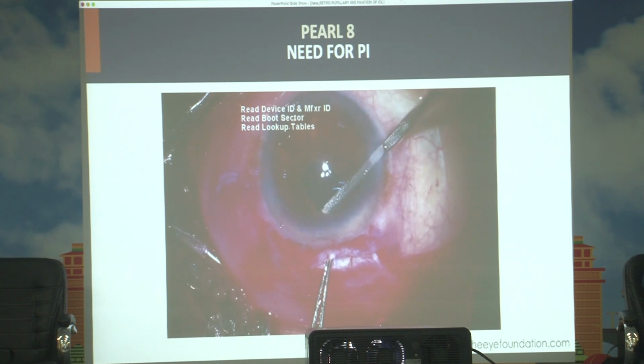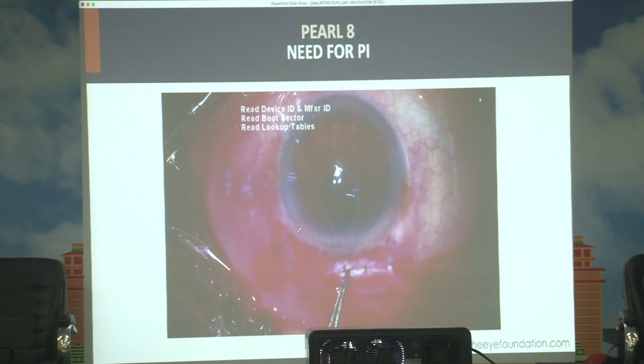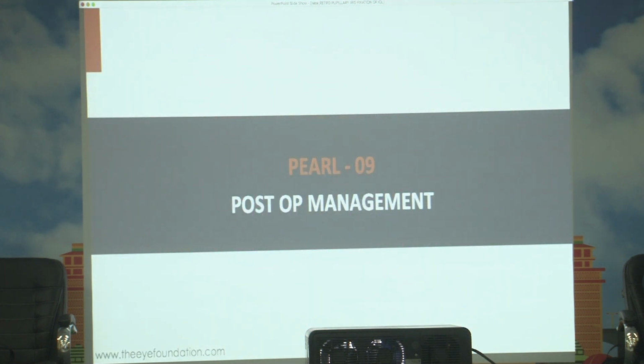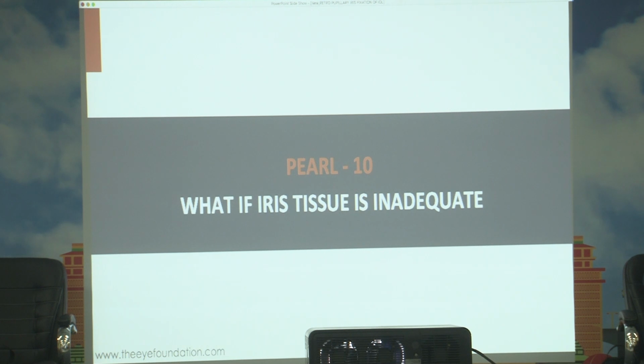And sometimes, if it's a superior tunnel, you can go to the side port and nudge the iris out so that you are able to pull it out and do a PI. Post-operatively, enough anti-inflammatory is needed.